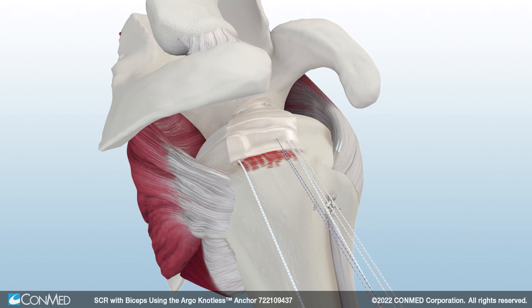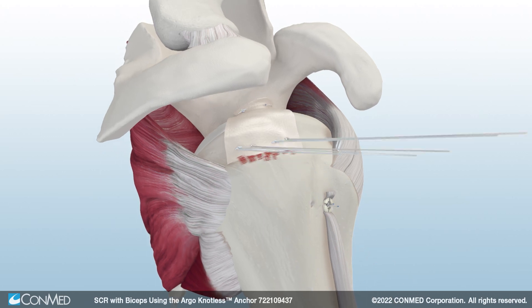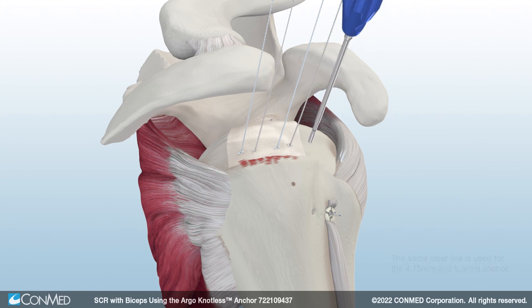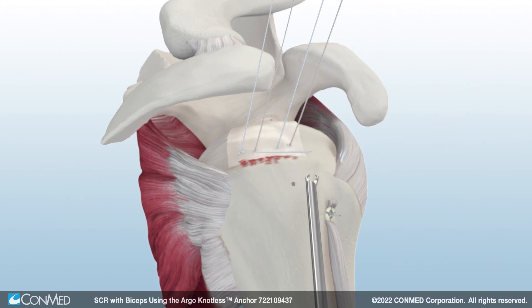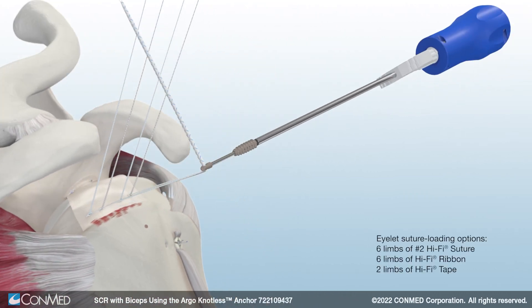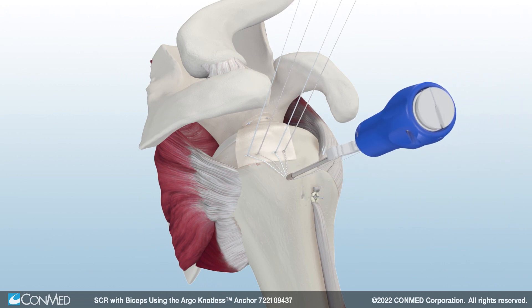ConMed's Hi-Fi Ribbon is tie-able, flat, and 1.3mm wide to provide broader compression. When passing is complete, tie knots medially. Next, insert the Argo Knotless broaching punch down to the depth mark. Then, load two Hi-Fi Ribbon limbs from each medial anchor into the Argo Knotless anchor using the black threader tab. Insert the nose of the eyelet into the pilot hole and set tension as needed by individually pulling and cleating each suture limb onto the white suture cleat while applying counter pressure to the back of the driver handle.